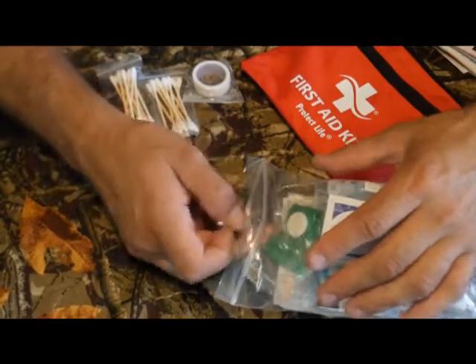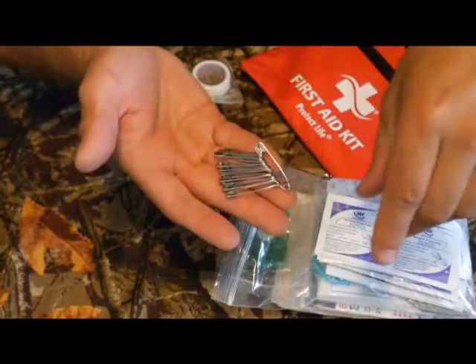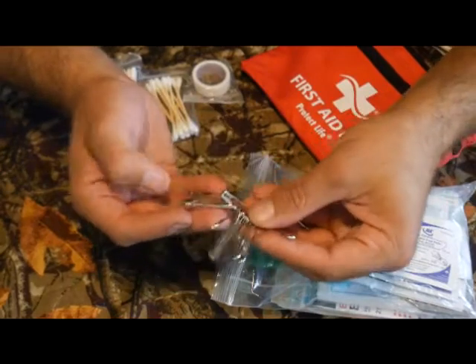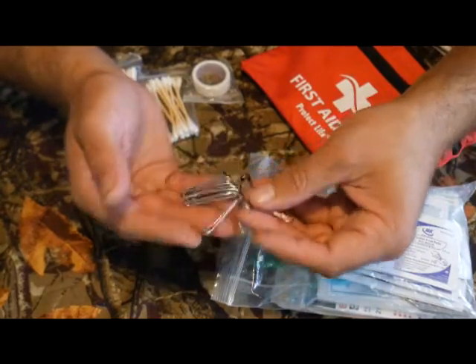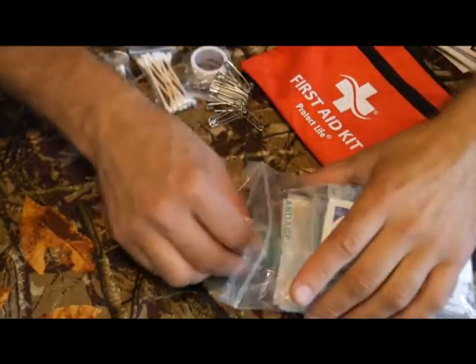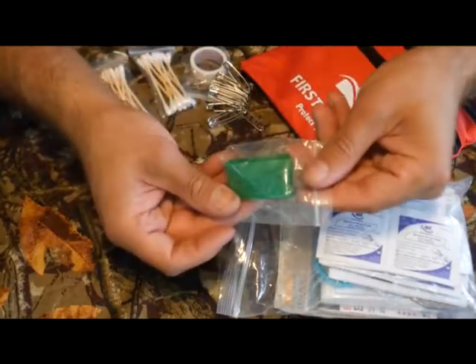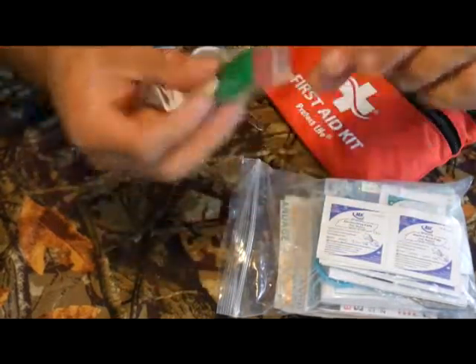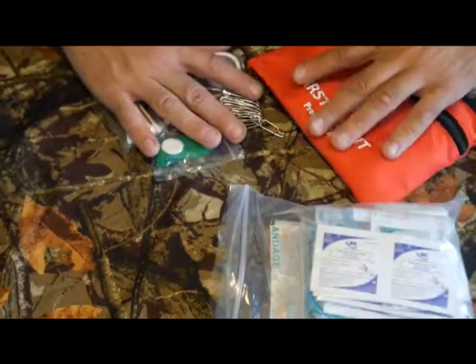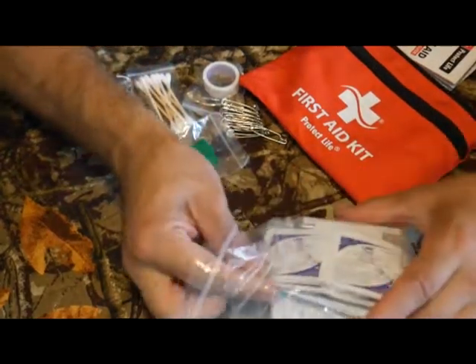Most first aid kits don't have these either — safety pins. These are great for use with a triangular bandage, fixing gear, and you can even use them as fishing hooks. Very versatile. There's also what I believe is a small tourniquet — I've never seen one quite like this before, so chime in if I'm wrong on that.